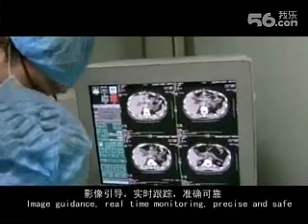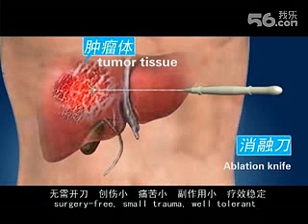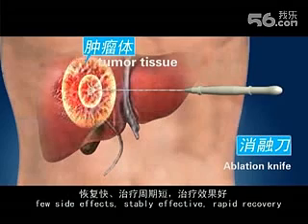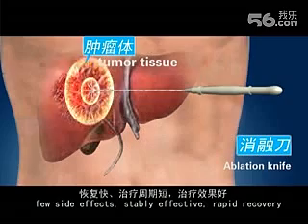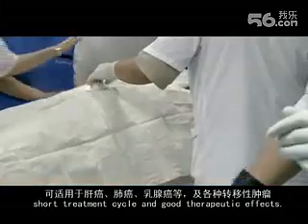Key features of the RFA procedure include: real-time monitoring, precise and safe delivery, surgery-free approach, small trauma, well-tolerated by patients, few side effects, stable effectiveness, rapid recovery, short treatment cycle, and good therapeutic effects.